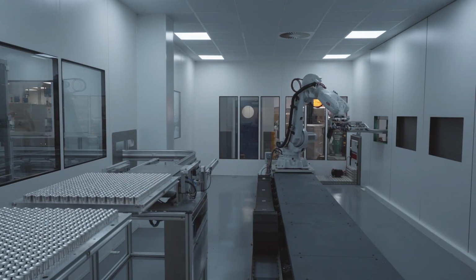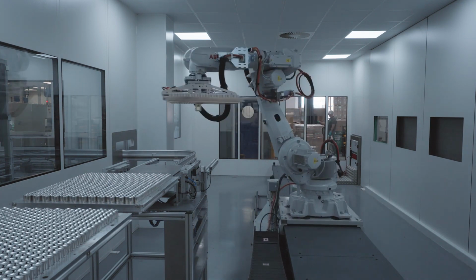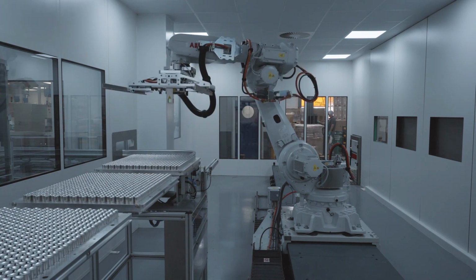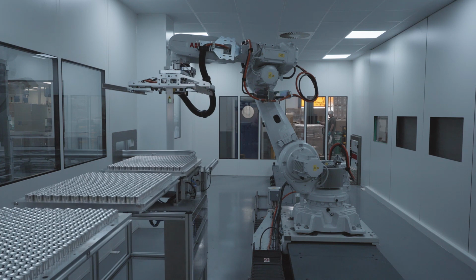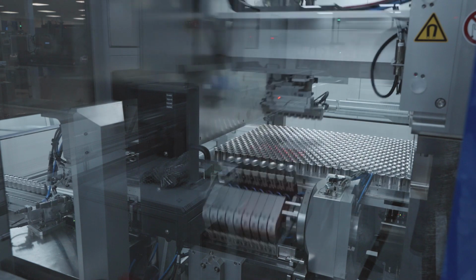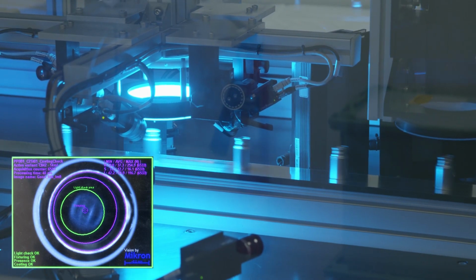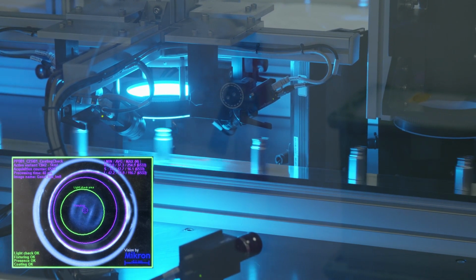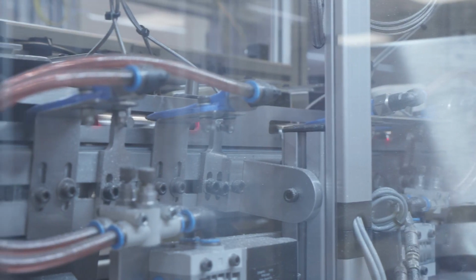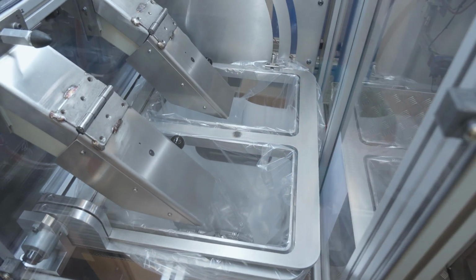Once complete, the jig is removed from the pod and placed back onto the monorail, where it is transported back through to the jig unfilling machine. The cans are then automatically removed from the jig by the machine. As the cans flow along the conveyor belt, they are 100% inspected for the presence of plasma by a camera vision system. The cans are then packed and placed into our warehouse, ready for shipping to our customer.